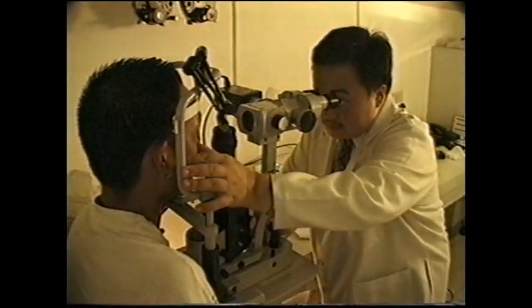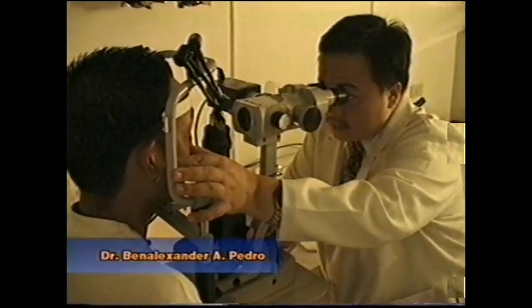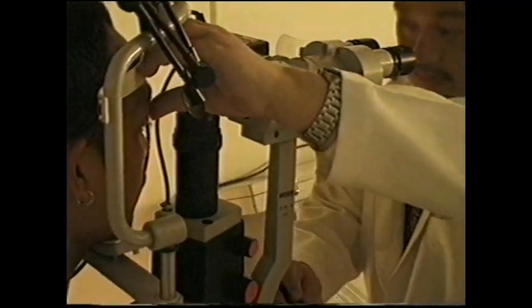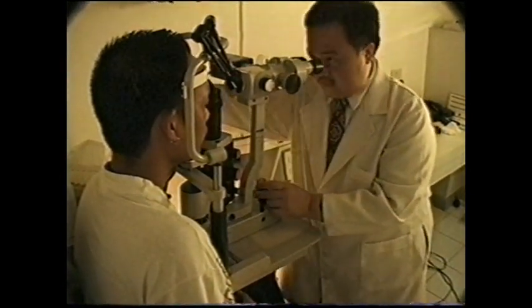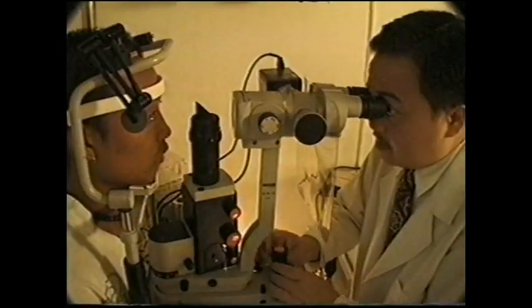The slit lamp biomicroscope is a unique instrument that permits magnified examination of transparent or translucent tissues of the eye in cross-section. The slit lamp enhances the external examination by allowing a binocular stereoscopic view, a wide range of magnification, and illumination of variable shapes and intensities to highlight different aspects of ocular tissue.